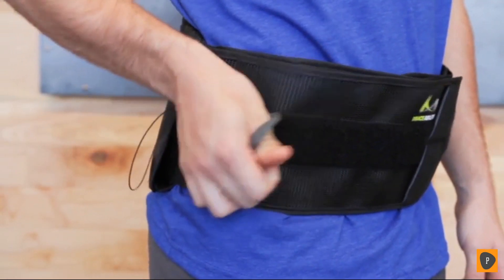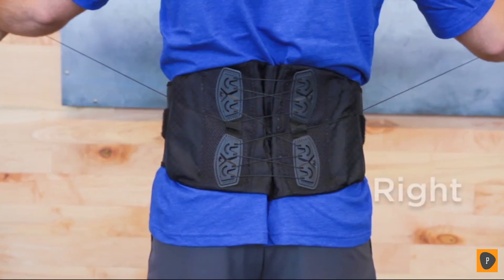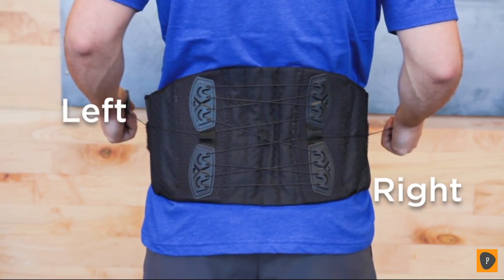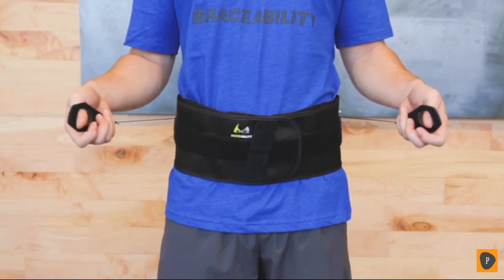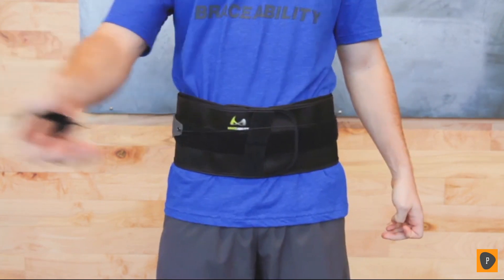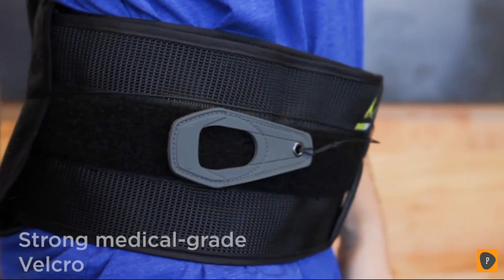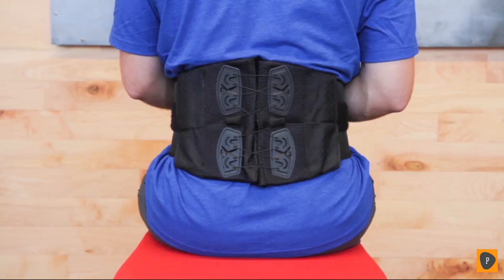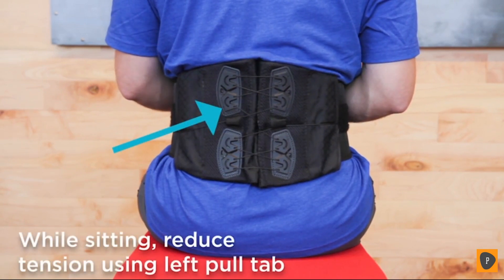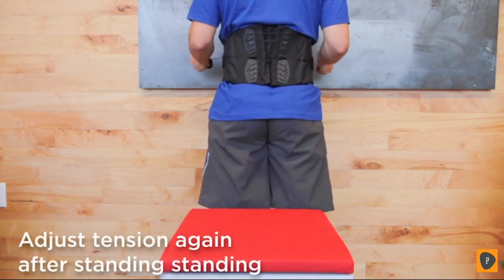Simply slide your thumbs through the pull tab holes and pull them away from your body. Your right pull tab controls lower compression and your left pull tab controls upper compression. Apply tension until desired support is achieved, then wrap pull tabs around to the front of the brace and secure the strong, medical grade Velcro to the Velcro compatible strip on the outside of the brace. For comfort while sitting, use the left pull tab to lessen tension on the upper portion of the back panel. Reapply tension once you stand up.